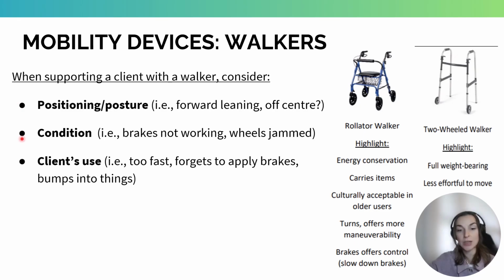Next is the condition. So if either brake is not working, that needs to be repaired. It's a priority. The other thing to look for is jammed wheels. Sometimes they can become jammed from debris.